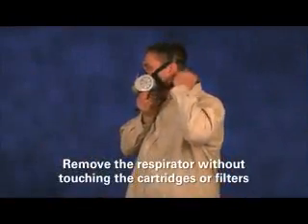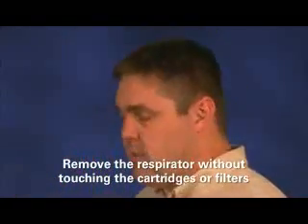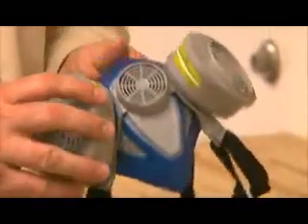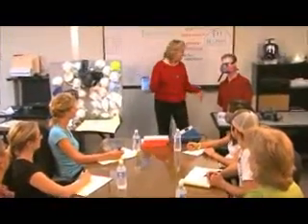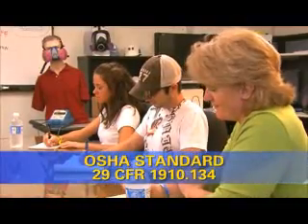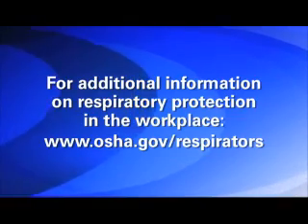When you have finished wearing the respirator, carefully remove it by loosening the straps and taking it off without touching the cartridges or filters, because they may be contaminated. Follow your company's procedures for maintenance of the respirator, including proper cleaning and disinfecting and storage. Remember, respirators must be used in the context of a comprehensive respiratory protection program, according to OSHA Standard 29 CFR 1910.134. For additional information on respiratory protection in the workplace, consult this website.